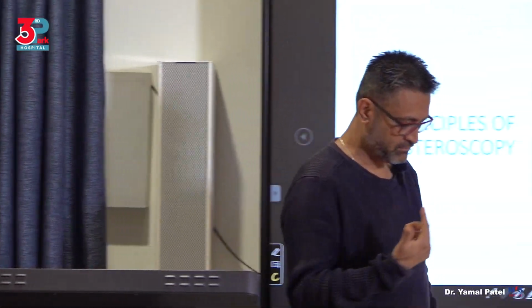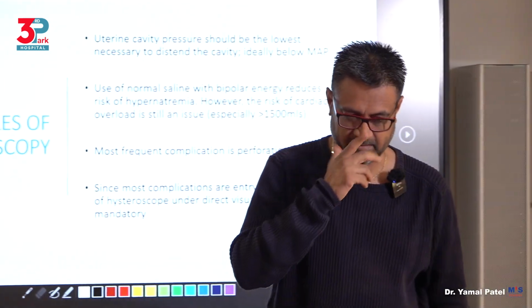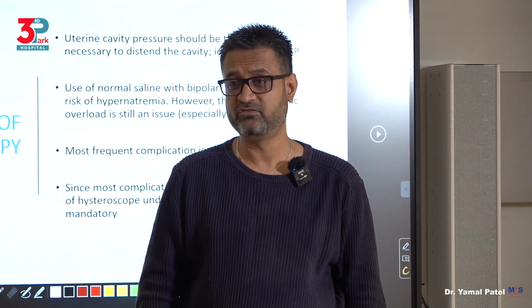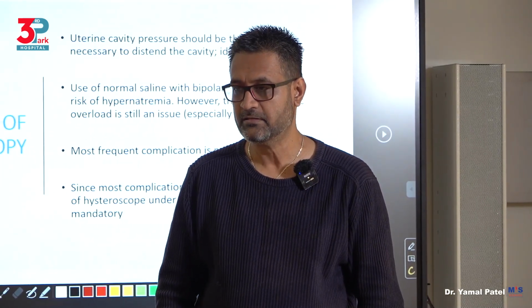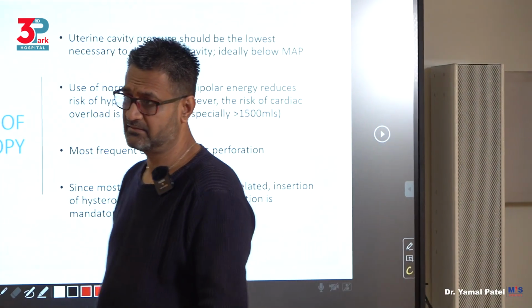So we've discussed this. So what are the few principles that I would say you should know about hysteroscopy? Now, hysteroscopy is a topic that I could probably divide into almost 8 to 10 subtopics for you. But I don't think we will have that kind of time to go into all the details.